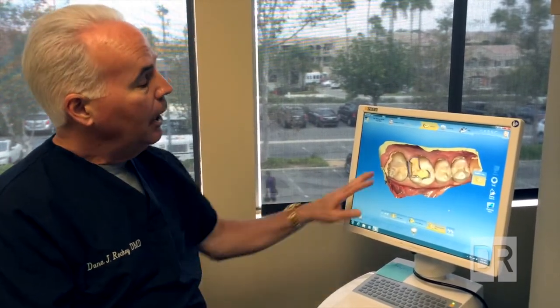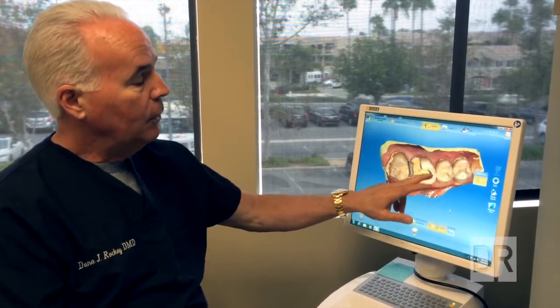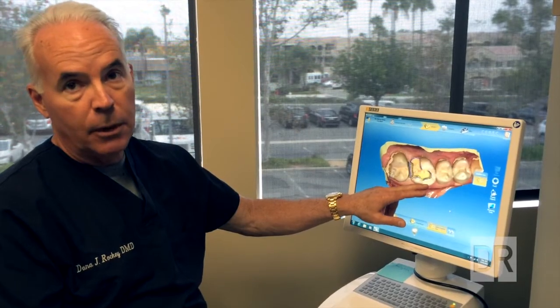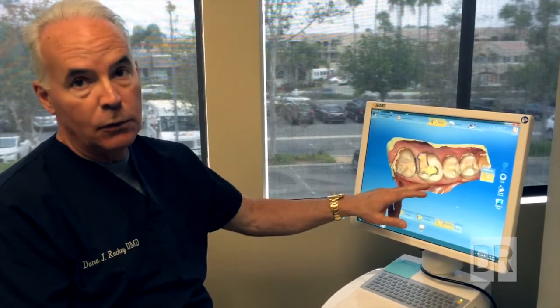With this machine, we can numb the patient up, clean out the diseased part of the tooth, leaving the rest of the good part of the tooth. That's an important point — this allows us to be much more conservative in our designs, leaving good tooth structure behind.